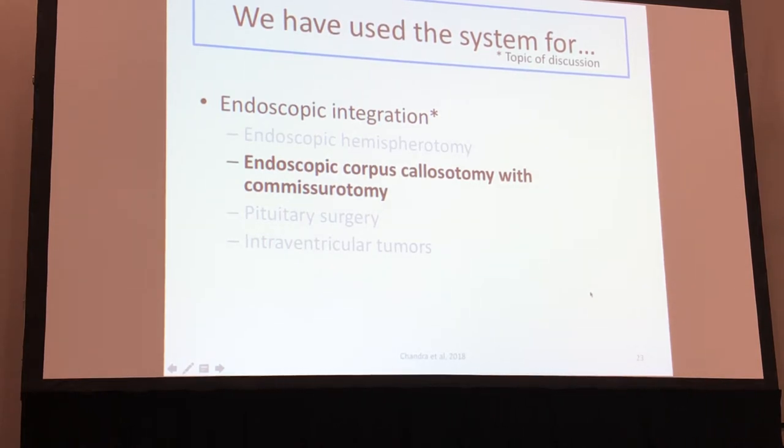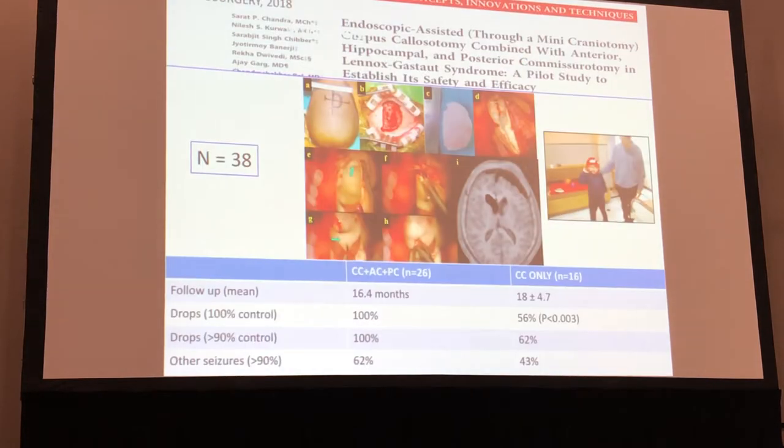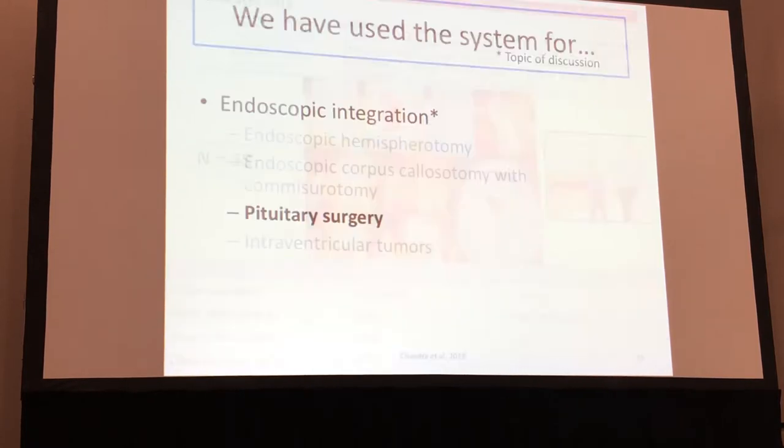And then we went ahead to describe the technique of endoscopic corpus callosotomy with commissure opening for a series of kids who were having Lennox-Gastaut with severe cognitive retardation, and they were having hundreds of seizures. So when we performed a complete corpus callosotomy through an endoscopic route along with pan commissurotomy, which included anterior commissure, hippocampal commissure, and also posterior commissure for the first time in the literature, we have had much better outcomes in this group of patients. Why posterior commissure? I don't have time to explain, but of course if somebody asks me the question, I can tell more details.